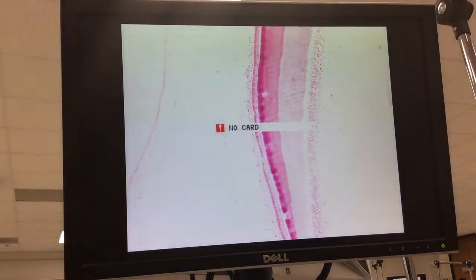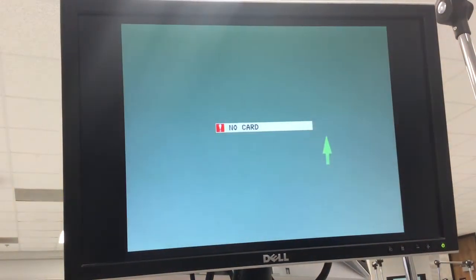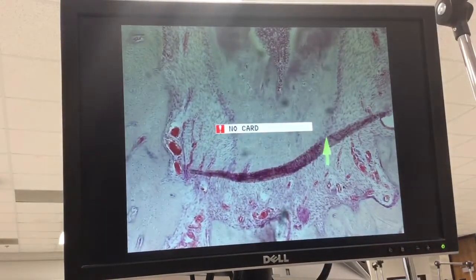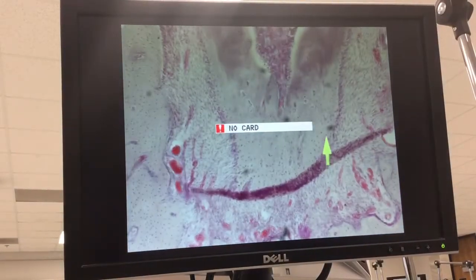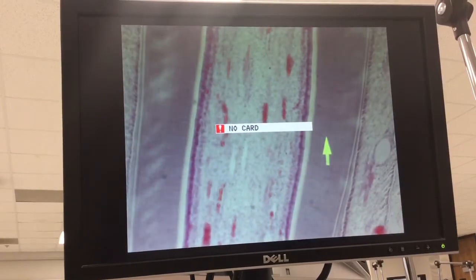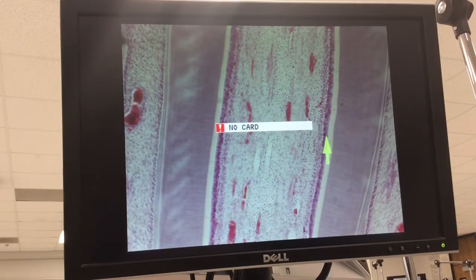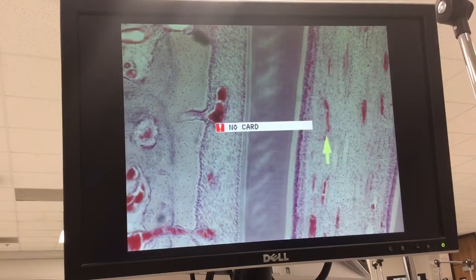Okay, well, that's dentinogenesis. So as we look at the mature tooth, that tooth in situ, these are demineralized, and so the, oops, that's the wrong one. The enamel will be gone. Here's the apex of the tooth. And as we come up here, we can see predentin. There are the odontoblasts. Here's the rest of the pulp.